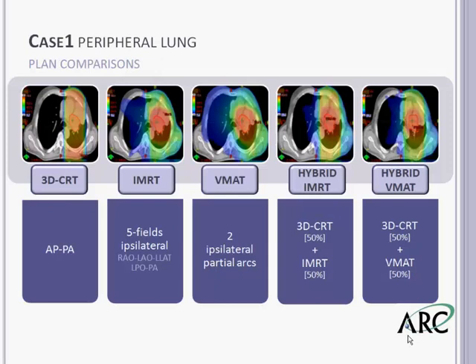Looking from left to right, we have our five plans. The 3D CRT plan was simply an AP/PA. Next to that is our IMRT, which consisted of a five-field ipsilateral arrangement. In the middle is a VMAT plan using two partial arcs contained to the ipsilateral side. Finally, our 50/50 weighted IMRT hybrid and our hybrid VMAT, again 50/50 weighted.